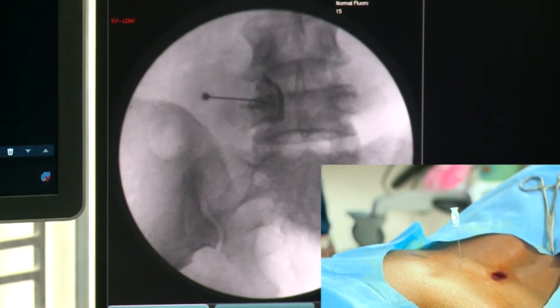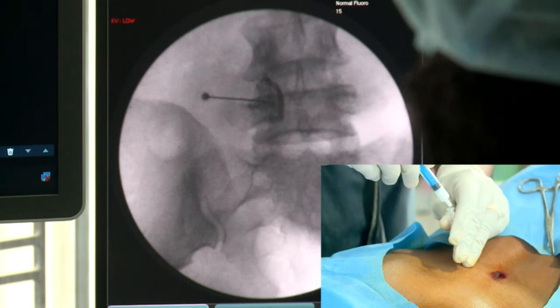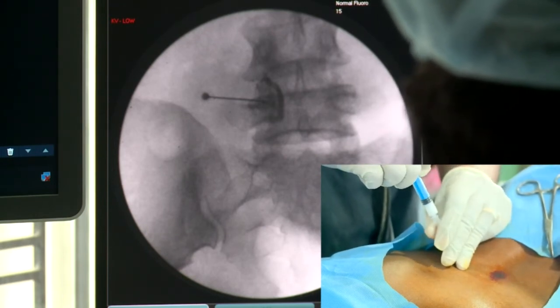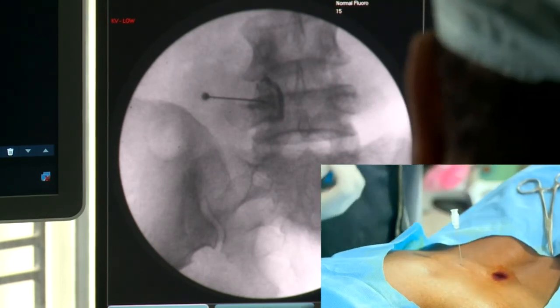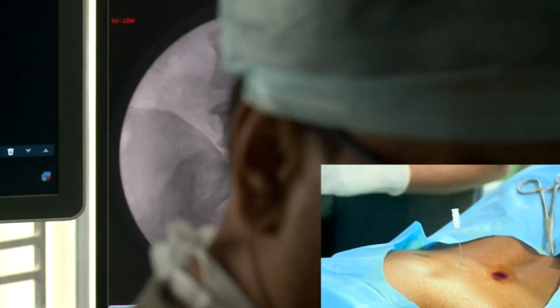I have injected only around 0.2, or even less than that. And now I will be injecting more. You see the dye will be diluted — the dye has diluted, which indicates that I am there.